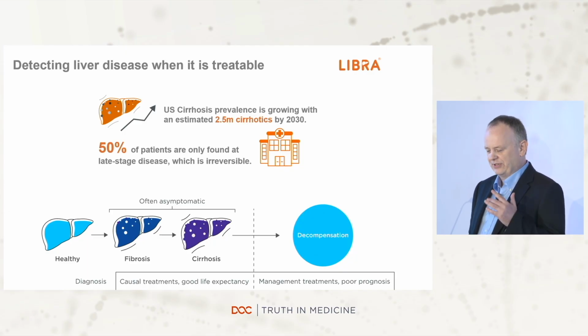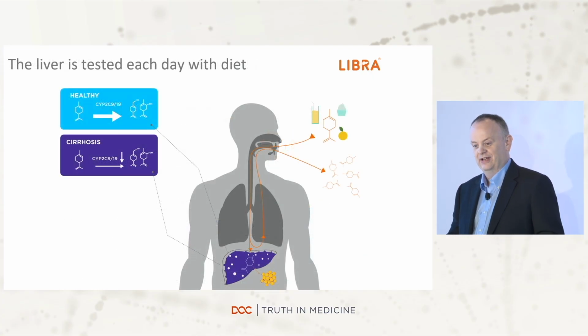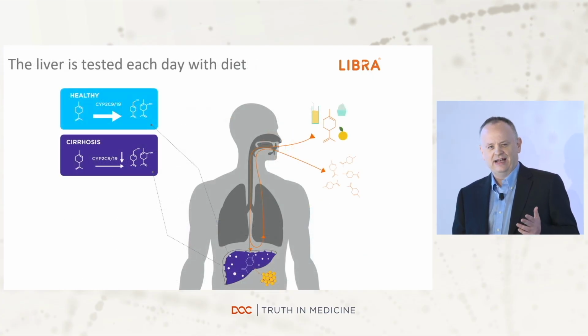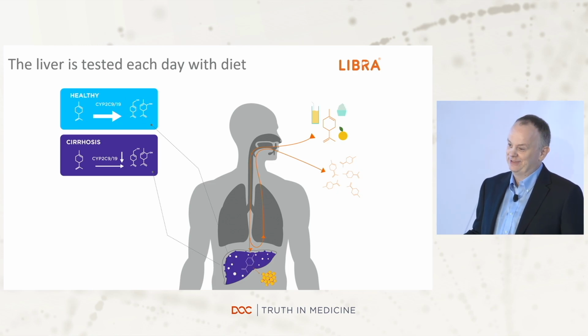And here we were looking and thinking, how can we use a breath test to help this? And actually, you test your liver every day when you eat food, drink, particularly alcohol.